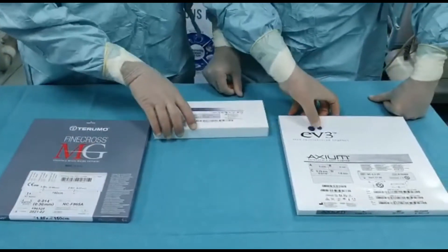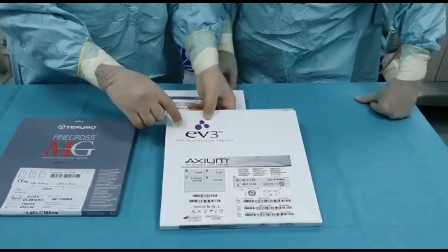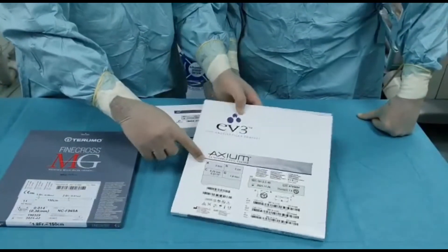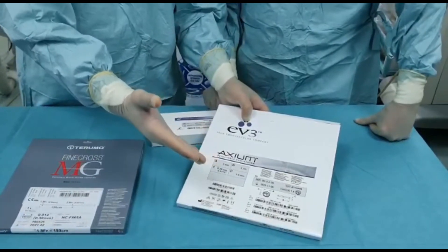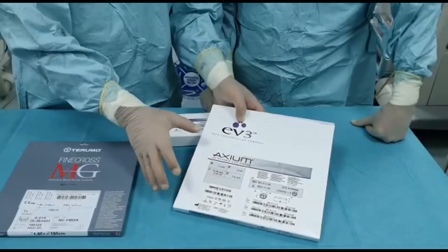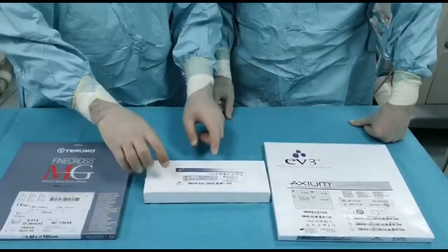Then you need to get the specific coils. In this example we have the Axiom coils. You can see the sizes here — this is the diameter of the vessel. If the collateral is about two millimeters or less, you can use a two millimeter coil, and there's the length of it. The third component is the detacher.